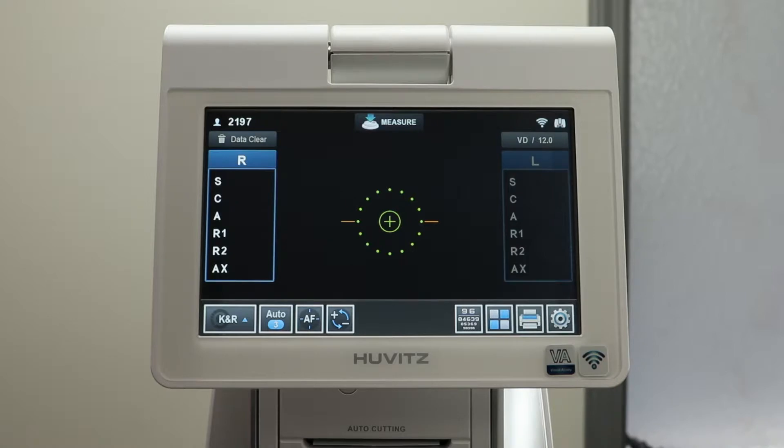On the right-hand side, you have the user setup icon, the printer icon, and the main menu icon, which opens up more features that the HRK-9000 offers. And finally, the visual acuity mode icon.